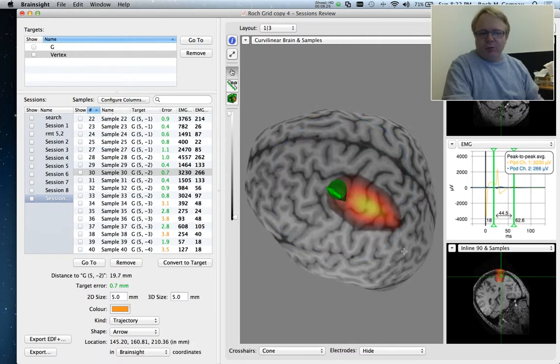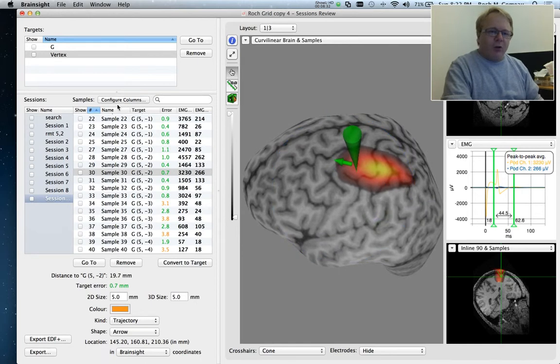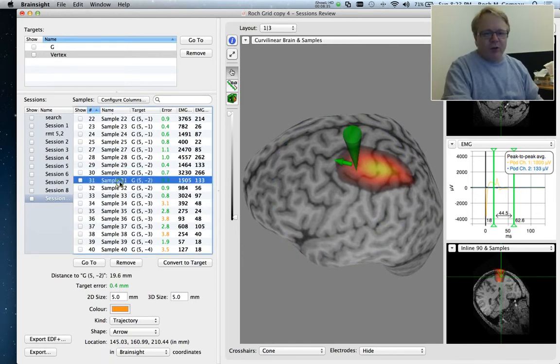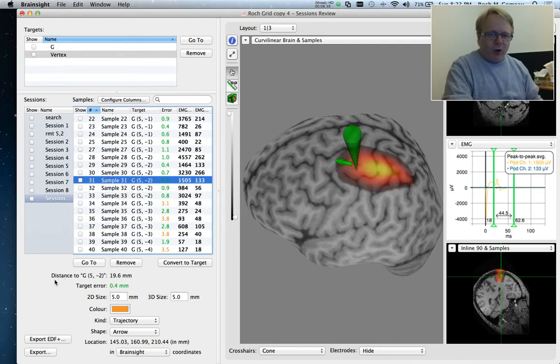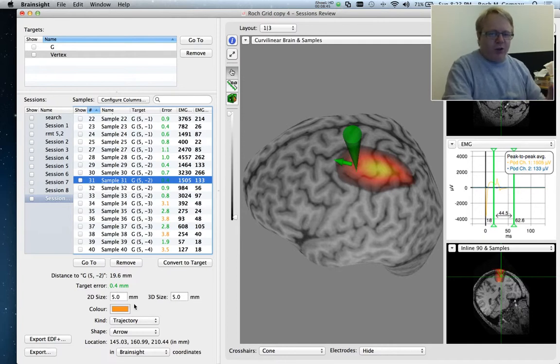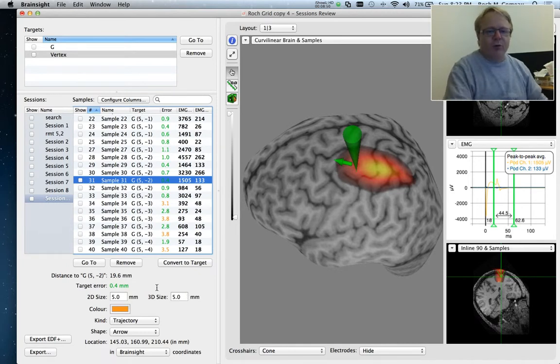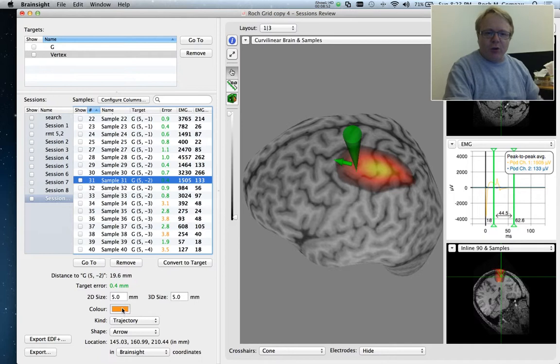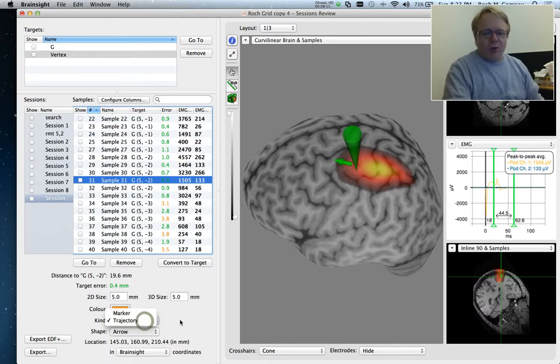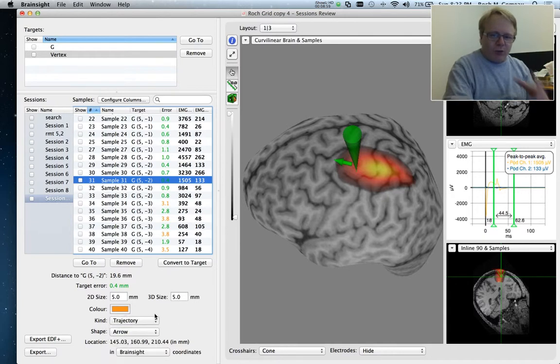So that's a basic way of looking at your data. Now, of course, we've acquired all this information. So here, whenever I select one of these samples, we show all this information that we've acquired. So the distance to the target, the error from target. We can change the visual representation of the data. So you can tailor that screen to however it is you want to see it to properly interpret your information. We can change the color if we're not doing the online mapping. We can change it from a trajectory to a marker. We can change the shape just for visual representation.